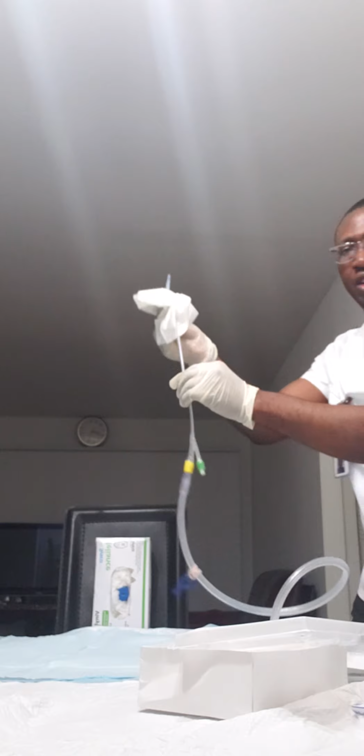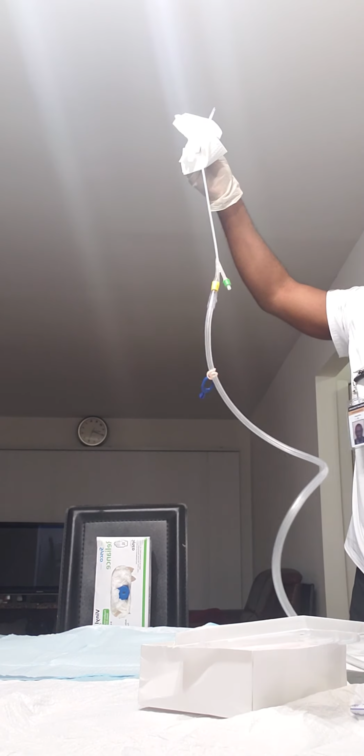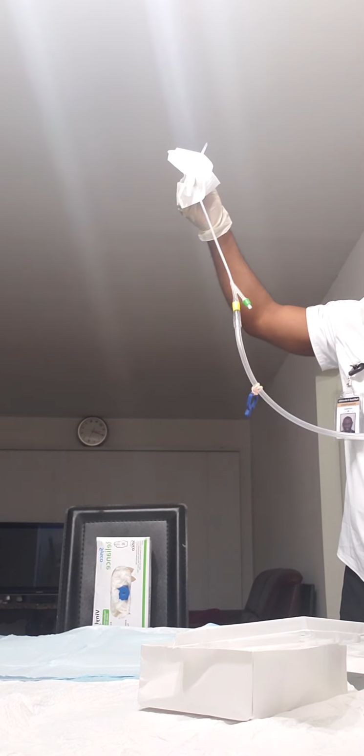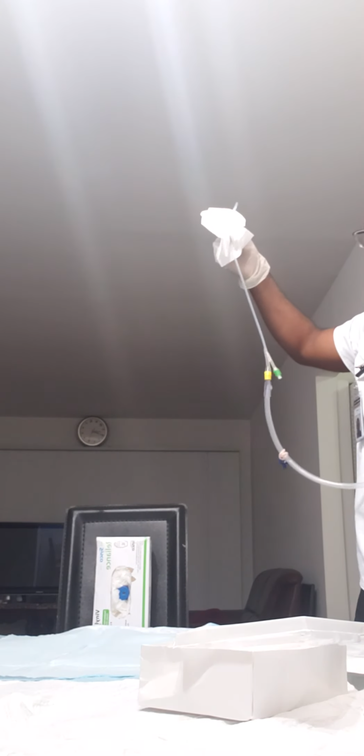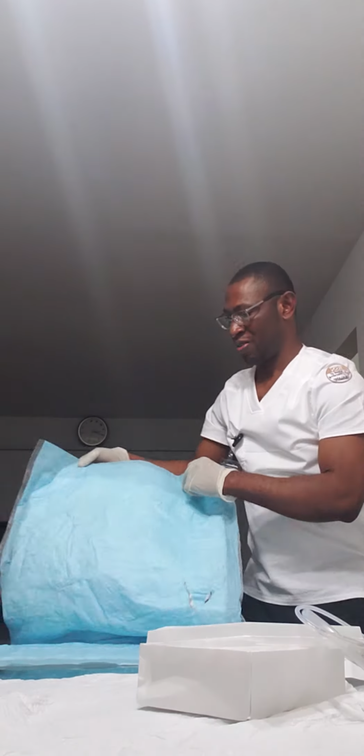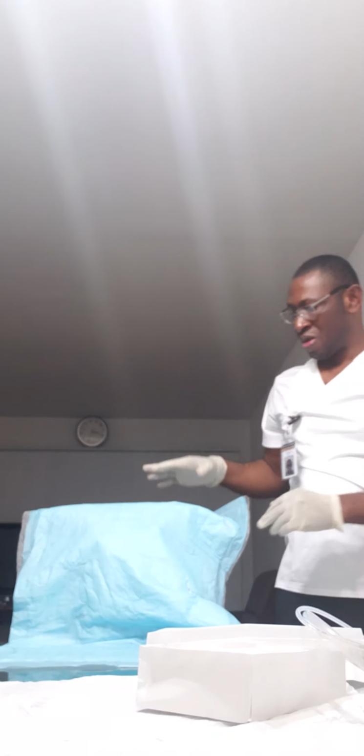Take it up and make sure the urine collects down here. When the urine finishes collecting down here, I have to measure the urine and take it off. After taking it off, I trash this, clean up the place, and cover my patient back. Then lower the bed and put the handrail up.